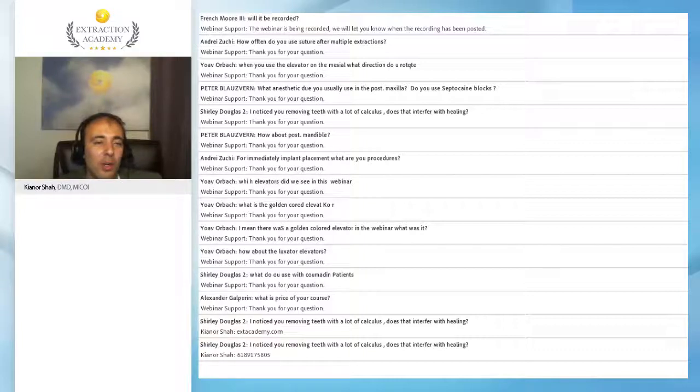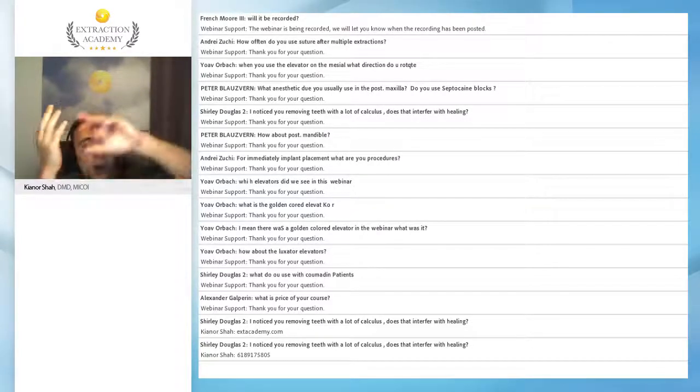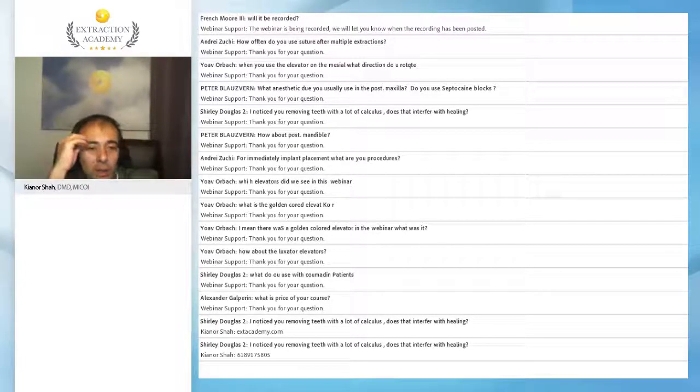The younger crowds are now starting with these power elevators, and they're good. They're not a bad thing. They need a solution for the buccal or lingual bone where the pad is placed, because there's a pad that creates a new fulcrum outside, in the lingual or the buccal. Underneath the pad, they put some gauze now in order to prevent the pressure that you're creating as you're elevating the tooth out of the socket, so you don't have a fracture line there.